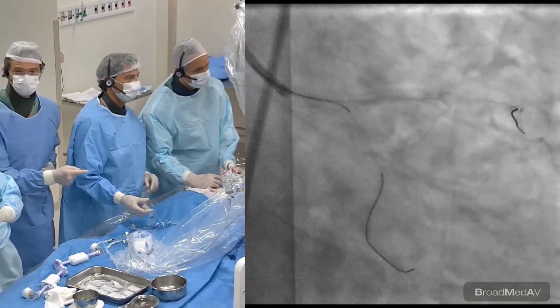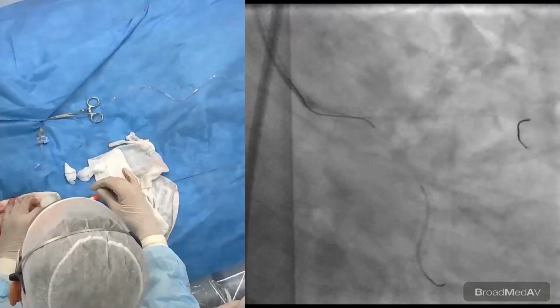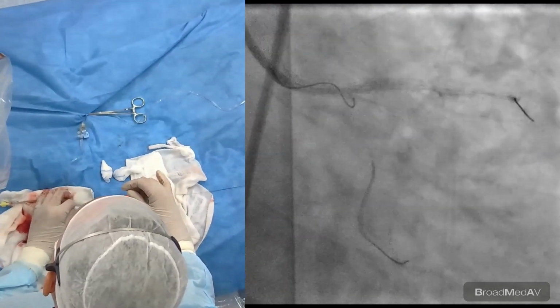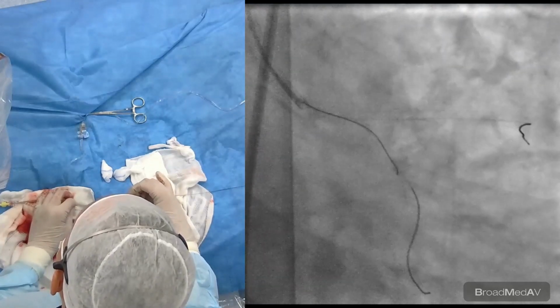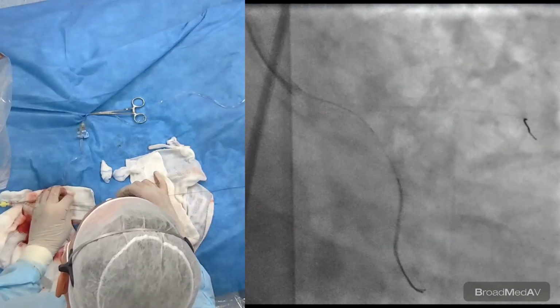Can you show the hands a little bit? Zoom in the hands just to see what he is doing with the control wire, please. Yes. I think now we just need to enter. Yeah, good. So it went well. I like the position here.